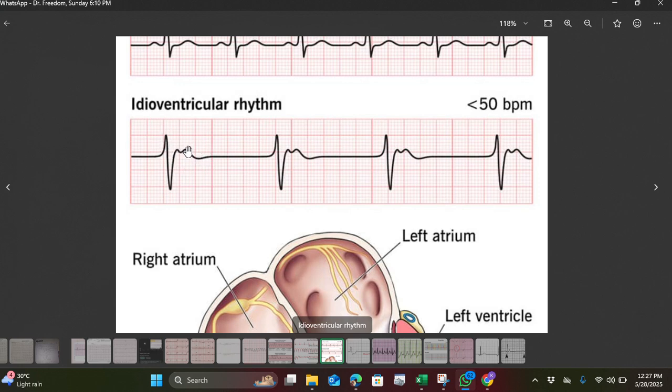That is, you see this M shape, it's just like a sign to show you that there's something wrong with the ventricles. Now, another thing I also need you to note is that from the name of the disease, from the name of the abnormality, you should be able to know where to look.